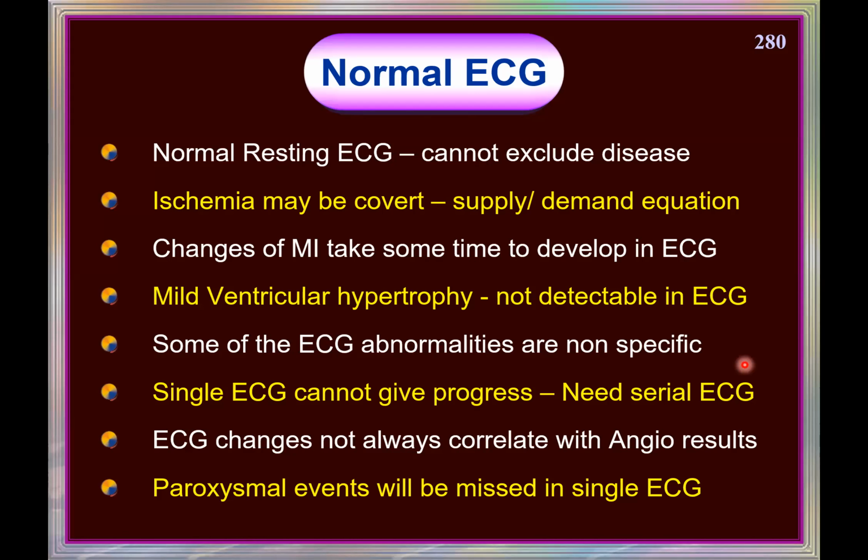Resting ECG cannot exclude disease. Understand? If the resting ECG is abnormal, it can predict disease. It is a specific tool. But if it is normal, it cannot exclude disease. It is not a sensitive tool.